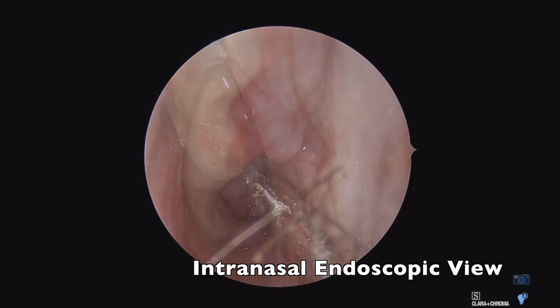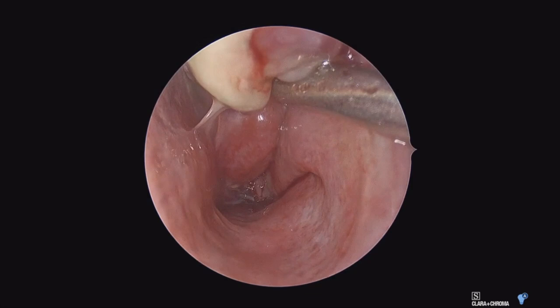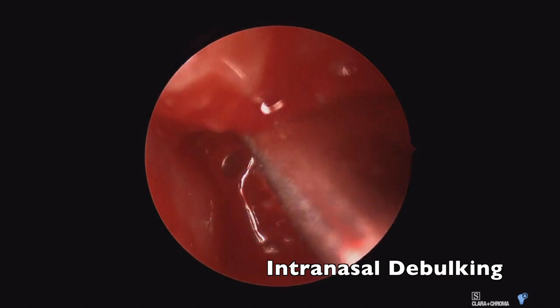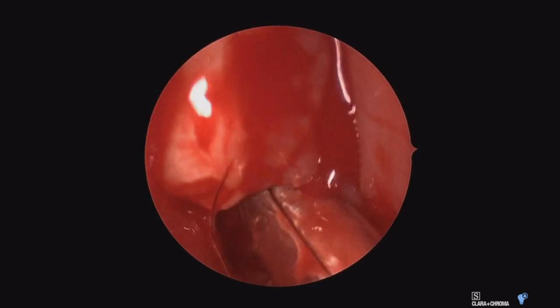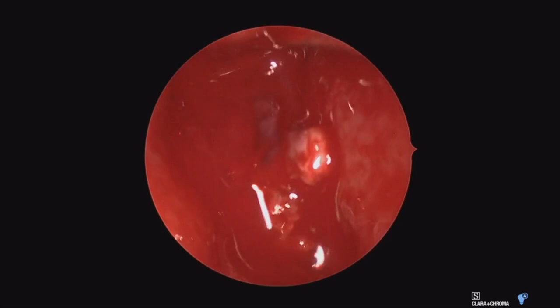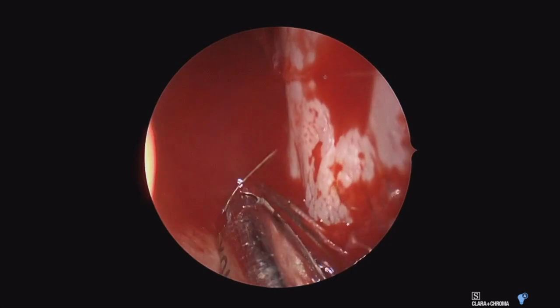Here we are now turning our attention to the intranasal portion of the case. We'll first track and map out the tumor. It's very important to debulk the tumor that is freely hanging in the nose without any mucosal attachments, especially the area towards the nasopharynx. This will allow egress of blood into the nasopharynx, creating an egress port to improve visualization throughout the case.